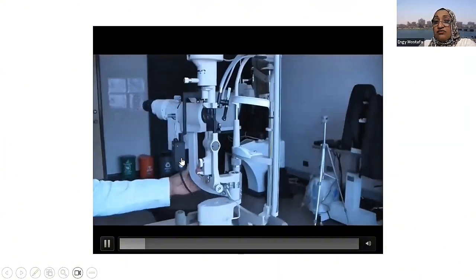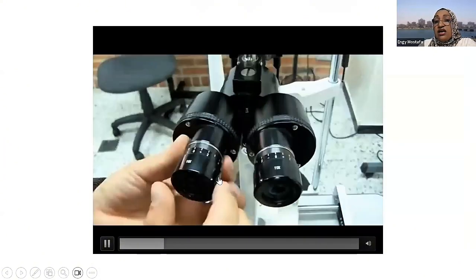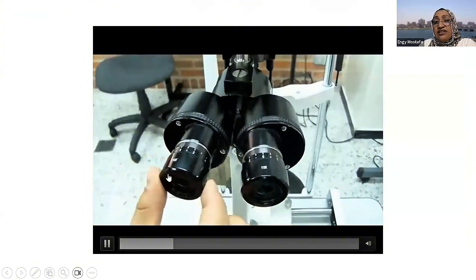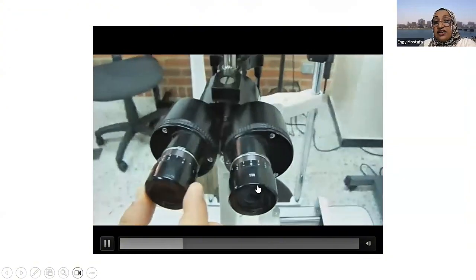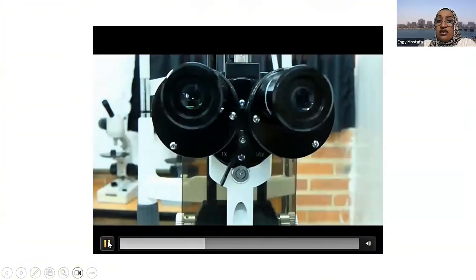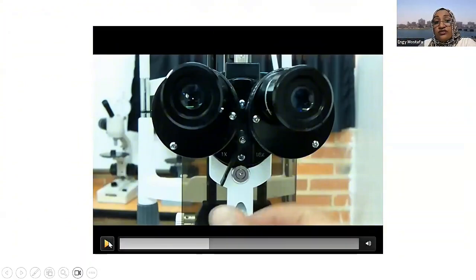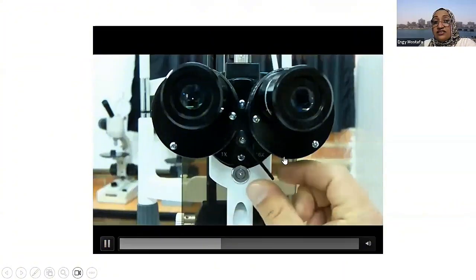And here are the lenses. These are plus 10s. You have to make sure that they are set to your own power, so that you have the optimum vision. Of course, this is the magnification. This is 10 times and this is 16 times.